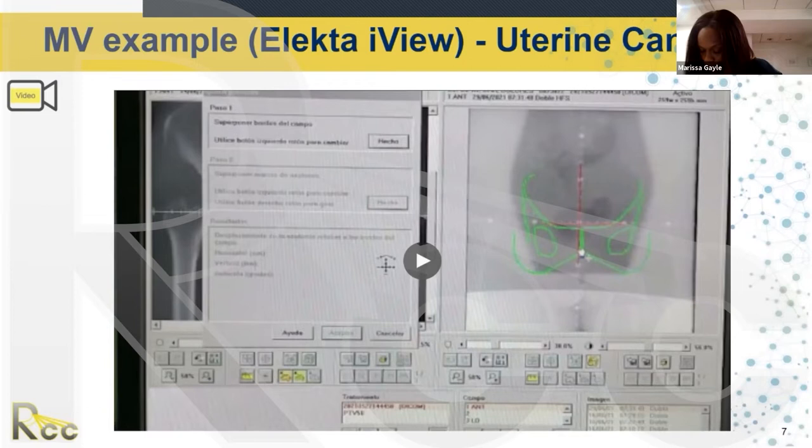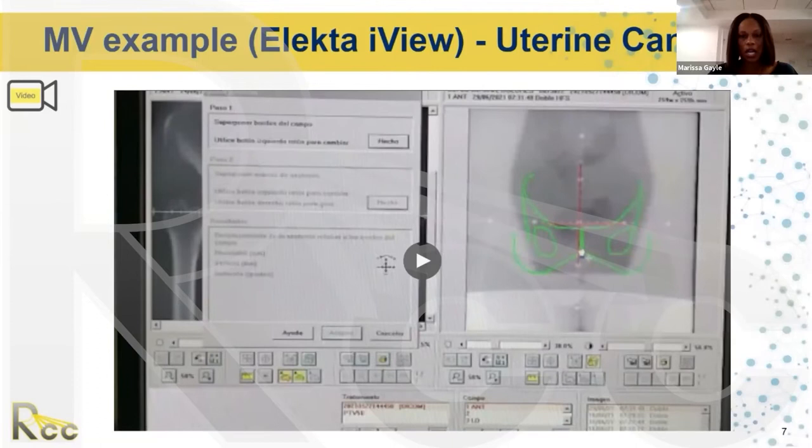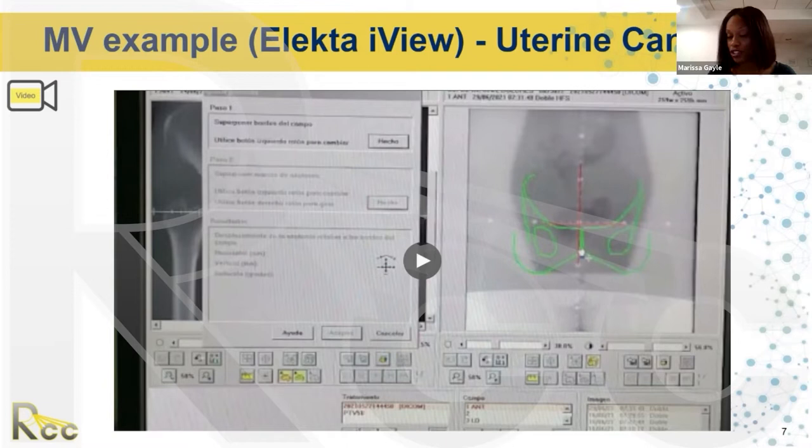The next example is from an Elekta, and this source came from Yeni Candanas in Peru. I've never worked on an Elekta before, so I'm going to go over the instructions they provided and describe it first before playing the video.